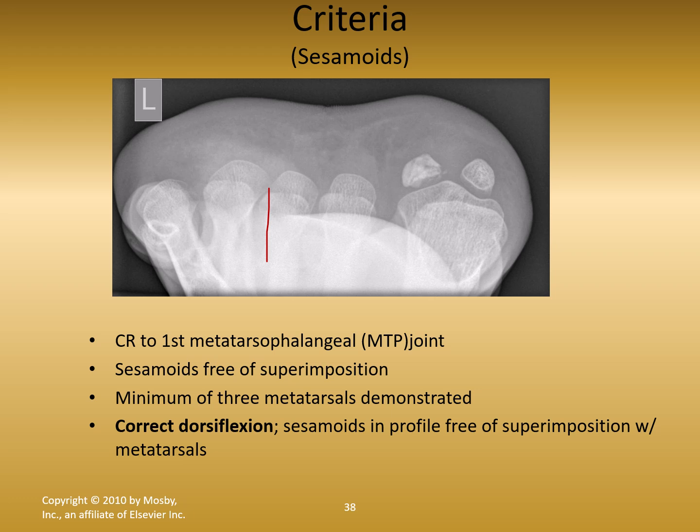Okay. Now I want you to note that the sesamoid position is considered a tangential X-ray beam, because it's going to skim the ball of the foot. So remember, a tangential projection is going to skim a rounded body part, and that's exactly what we're doing here.